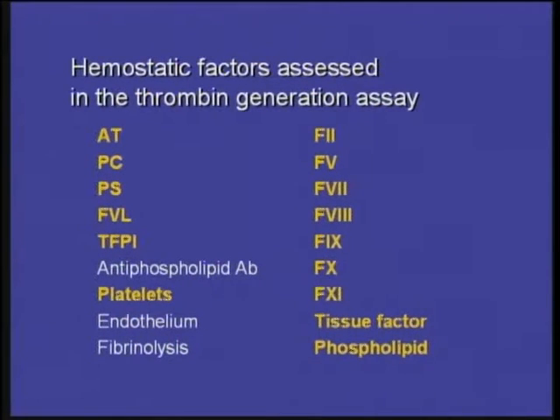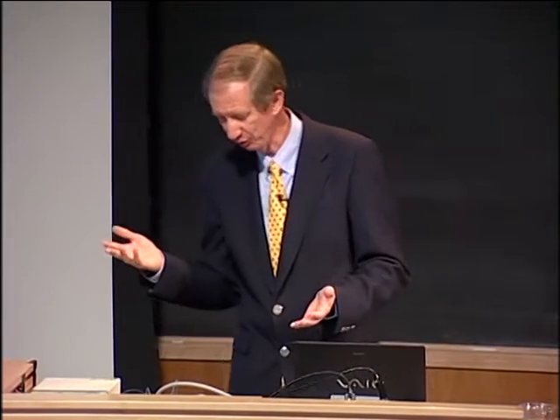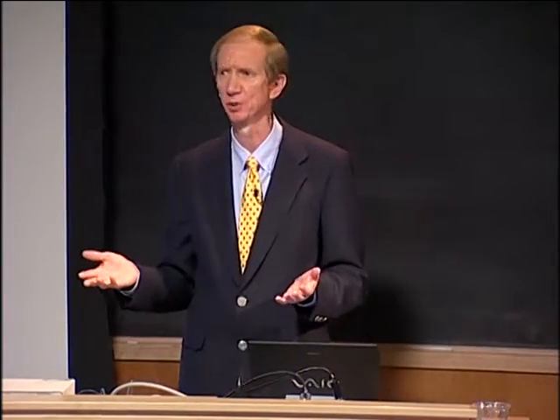So in a sense, this is what the thrombin generation assays can essentially evaluate. To some extent, they evaluate the same factors that we do individually, but they're evaluating overall in sort of an average. Plus, they evaluate a lot of other factors. So they're adding all of these things up at once to see what the overall picture is. So you could imagine somebody that maybe has factor V Leiden, but simultaneously they have a low level of some of the Coag factors. Not low enough to make you bleed, but maybe they're 70% of normal, that's just the way you are.